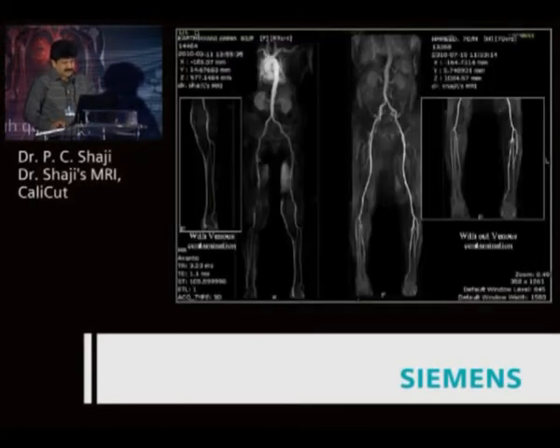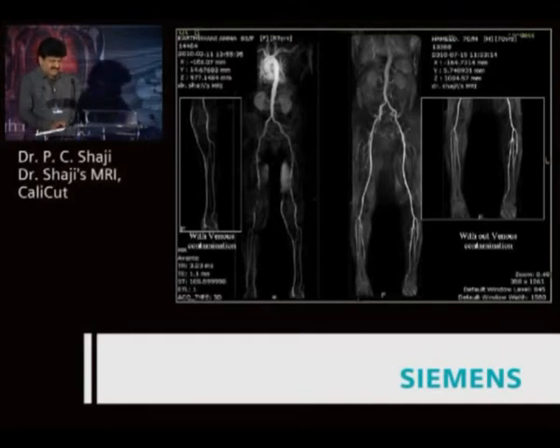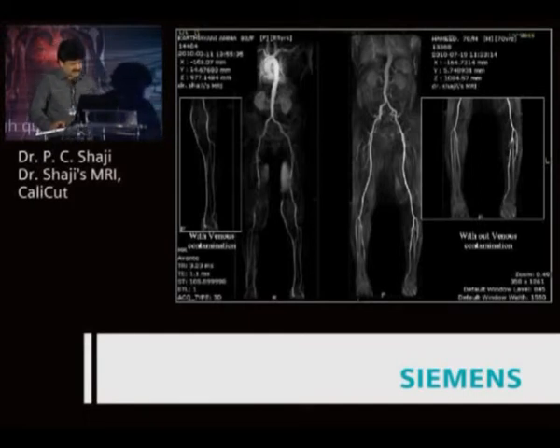So what we are doing now is we keep the tourniquet just above the ankle, and we found there are excellent results without any venous contamination. You can see on the left and right, of course, two different patients, but nowadays with the tourniquet just above the ankle, we are not getting any venous contaminations. I think it's an excellent technique to keep the tourniquet just above the ankle.